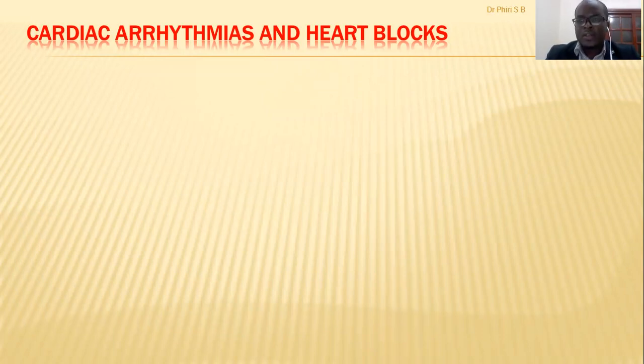So in Circulatory System Lecture 3, Part A, last time we were discussing the EKG recording or the ECG recording. We were looking at the 12-lead ECG machine. We use the 12-lead ECG machine to look at the heart. You have 12 leads, so there are 12 angles. We said of those 12 leads, we had 6 limb leads and 6 chest leads.